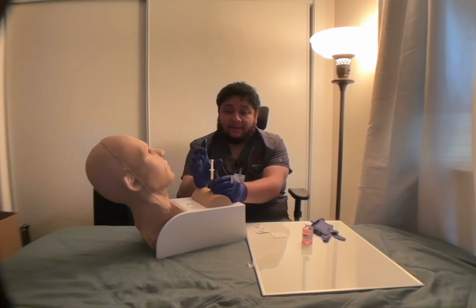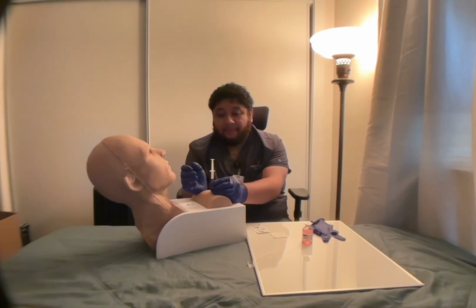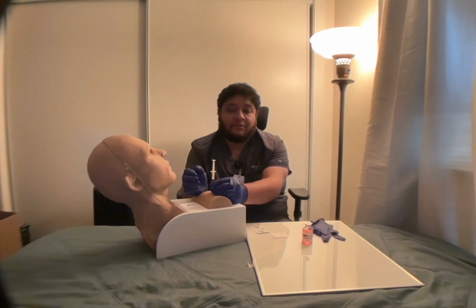With my dominant hand, I'm going to pull up on the plunger for about 10 seconds to make sure there's no blood return. Okay, wait 10 seconds. No blood return, so this site checks out.